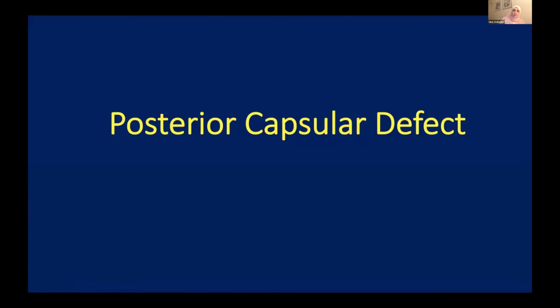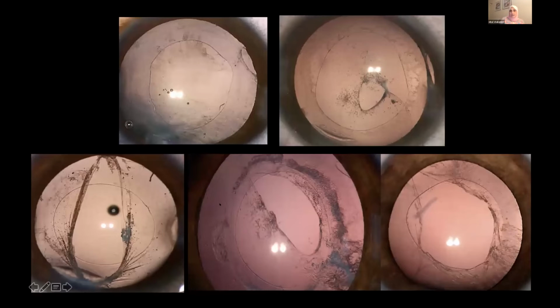Concerning posterior capsular defect, it is so variable. It may be central, it may be peripheral, it may be small, or maybe large. The large posterior capsular defect may have fibrotic edges or may be extending to the periphery and extremely irregular. How to deal with these defects?